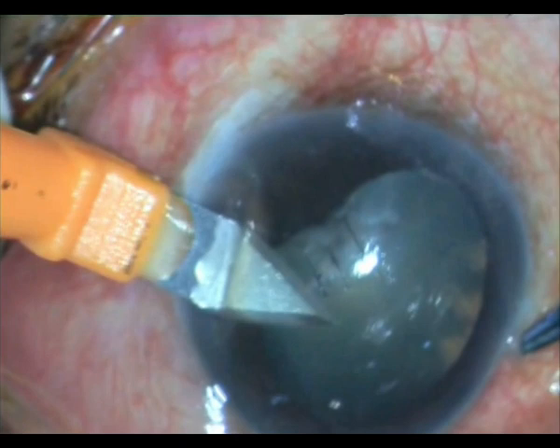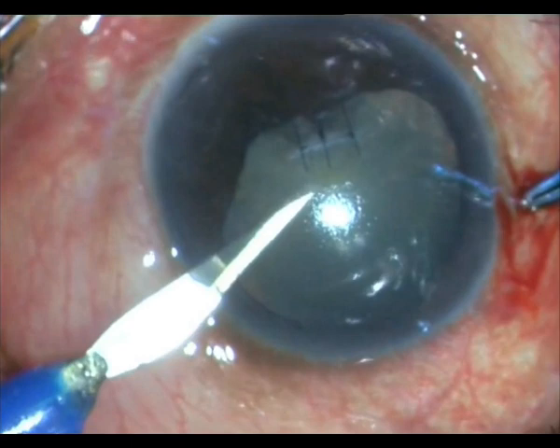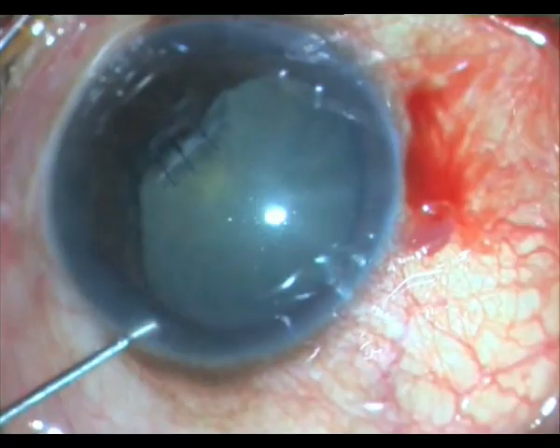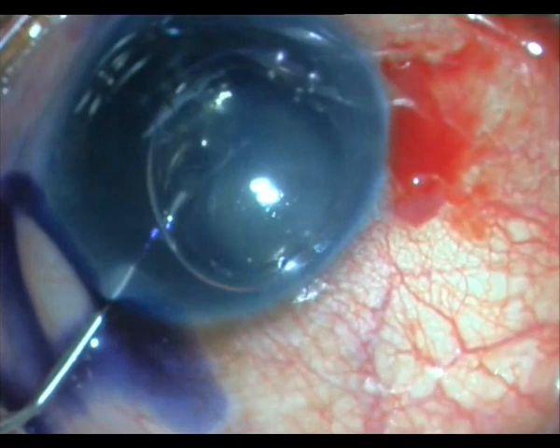As you can see, the corneal sutures are in situ, and you can also see the traumatic cataract. I place another incision — a 2.8 mm incision through the clear cornea. I attempt to go into the same side ports that I had made earlier, which sort of works.